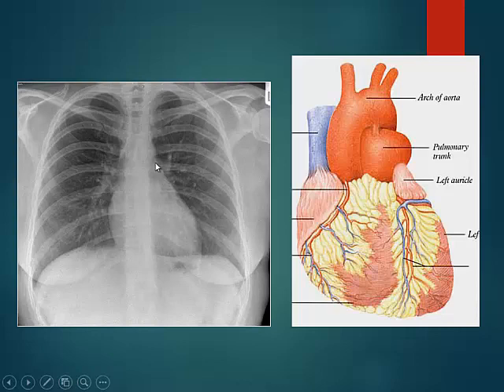And then above this here, what do you have? What is the structure I'm pointing to? That's the pulmonary trunk. The main pulmonary artery leads posteriorly into the left branch, and this passes over the left main bronchus, which you can just see here. Between the pulmonary trunk and the left ventricle, there is generally a bit of concavity here, and that is occupied by the left atrial appendage, right? And then you have the aortic knuckle formed by the aortic arch, this structure here.